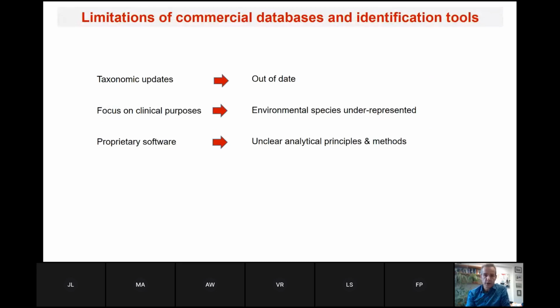As was presented by the previous speaker, identification based on MALDI-TOF relies on databases. And the issue is obviously whether these databases are updated, in particular when we are dealing with taxonomic groups where taxonomy evolves fast. This may be an issue, in particular in routine labs, because it takes time for the databases to be updated, as it's a complex process for the industrials.